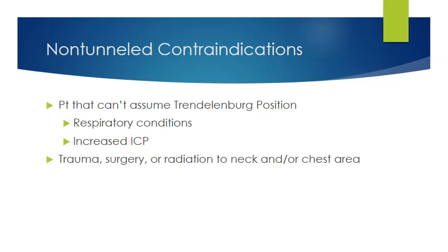Contraindications in a non-tunneled. We just said that we have to put them in Trendelenburg position. So if a patient can't be in Trendelenburg position, unless it's an emergent do-or-die situation where what you're going to do really isn't going to make a difference, you're always going to put them in Trendelenburg. And why would we worry about that? Well, if we can't put them in Trendelenburg, what would be reasons for that?